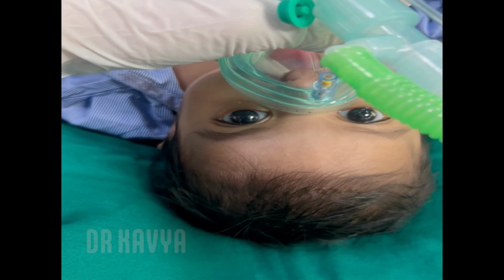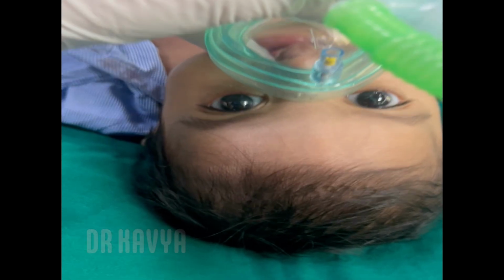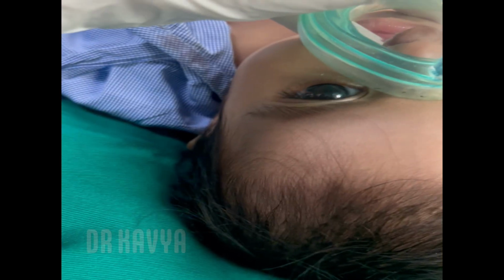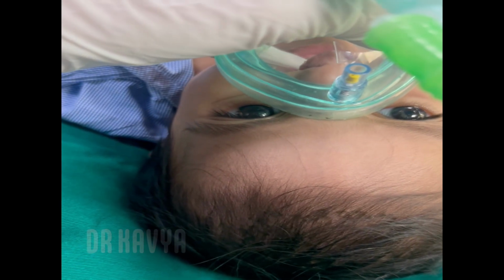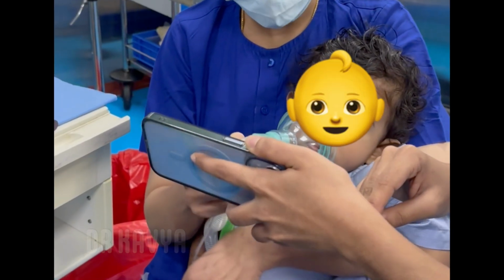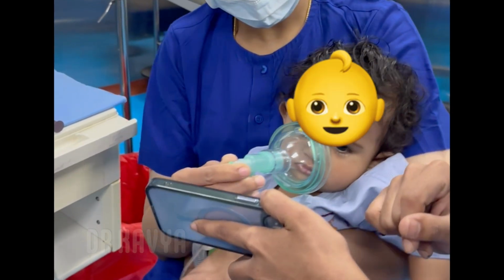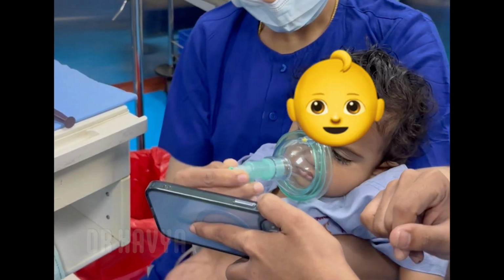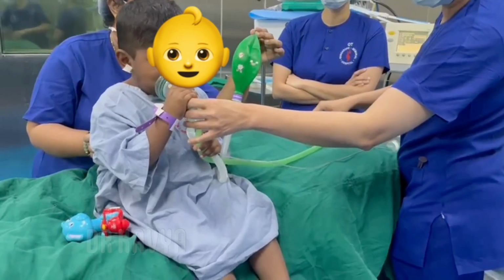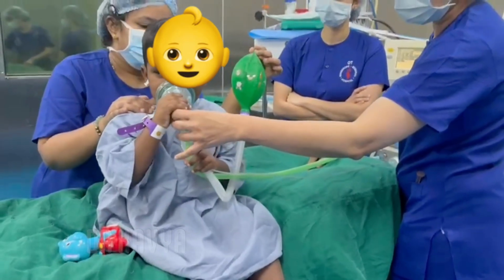In infants less than 6 months, the little finger of your hand is placed in their mouth while you hold the face mask near their face. They generally stop crying and eagerly suckle on your finger and go to sleep calmly. Preschool children can go to sleep watching their favorite cartoon videos on their phone. School-going kids are promised goodies if they perform the task of blowing the balloon well and are put to sleep.